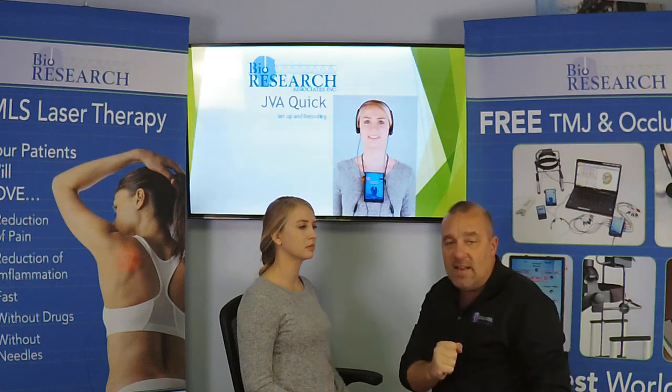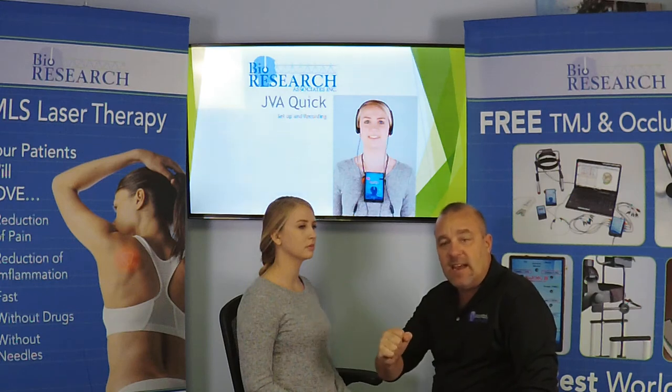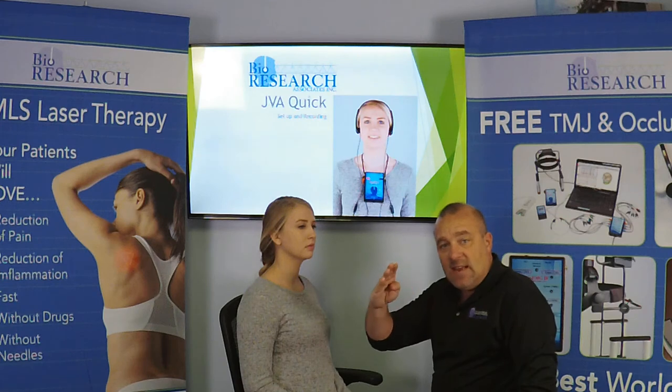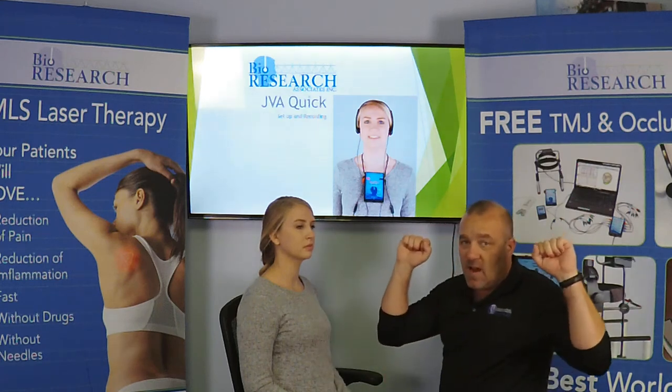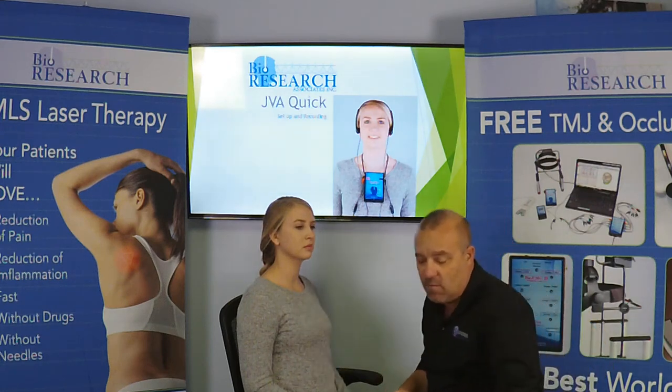Now this is a very important concept to get. What we're looking for is, is her mandible at midline when she's fully open? Or when she opens, does it deflect and stay out to one side? Okay? If she deviates while opening but then comes back to midline, that value is 0. Now, with a range of motion of 63, we can be fairly confident that both condyles fully rotate and translate. At 63 millimeters, she'll not be able to deflect left or right.